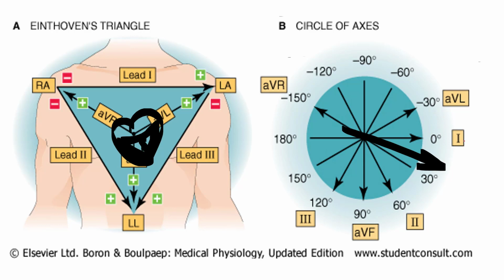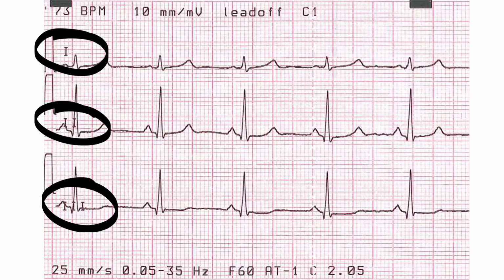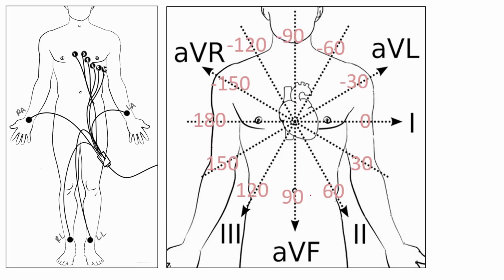Okay, again, what does this mean? It's telling us the average direction of depolarization of the ventricles if we're doing the QRS axis. The way we're going to do that is using the 6 limb leads that we've been talking about. Well, we've been talking about 3 of them anyway: lead 1, lead 2, and lead 3. Just with those, you can get a pretty good idea of axis, but we're going to use the other limb leads called AVR, AVL, and AVF.